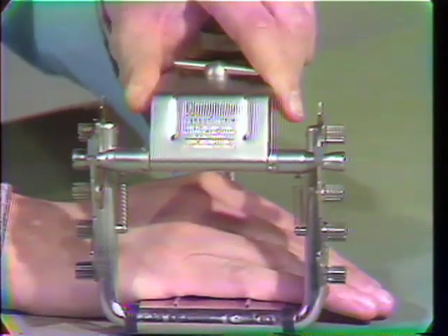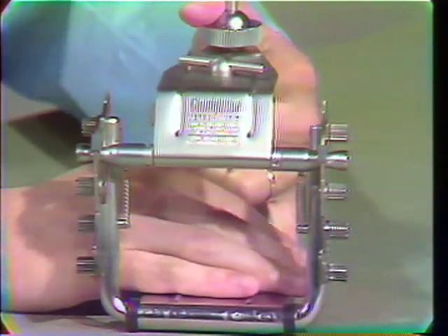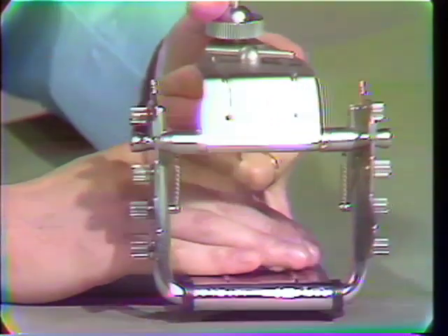Supporting cusps playing around in centric create a dimple working area in an antagonistic surface — consequently, it works like a pestle in a mortar. This can be observed in well-worn, good-functioning natural dentitions, as shown in this frontal section through the second molars of stone casts of a middle-aged person. Now let's go to the patient.